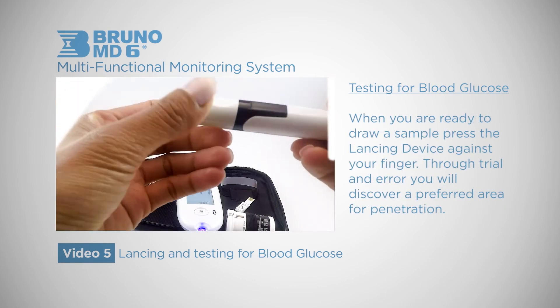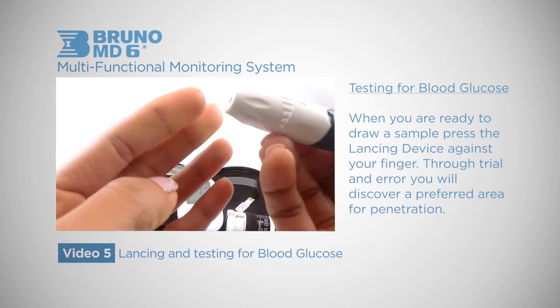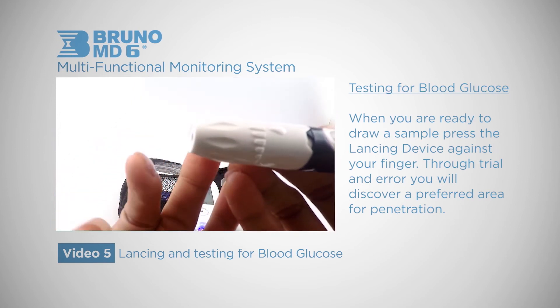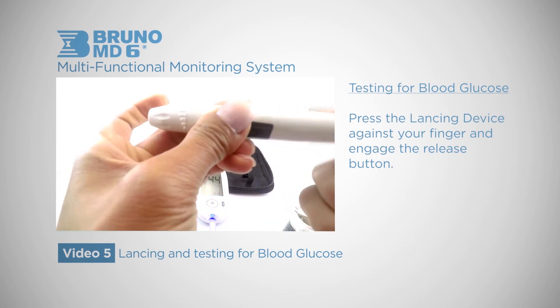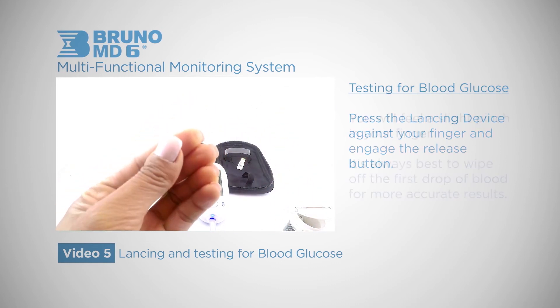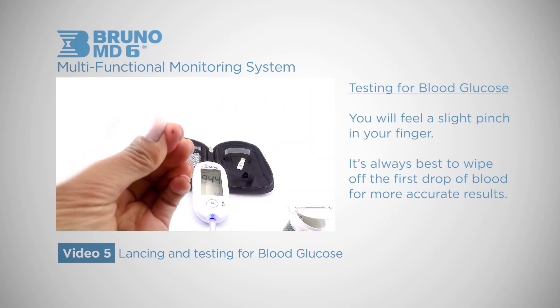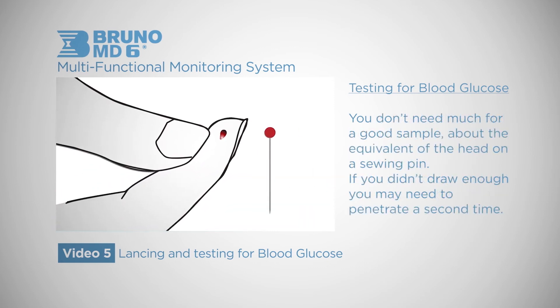When you are ready to draw a sample, press the lancing device against your finger. Through trial and error you will discover a preferred area for penetration. Some people like to use the side of their finger, but the fingertip is always the easiest way to begin. Press the device against your finger and engage the release button. You will feel a slight pinch in your finger. It's always best to wipe off the first drop of blood for more accurate results.